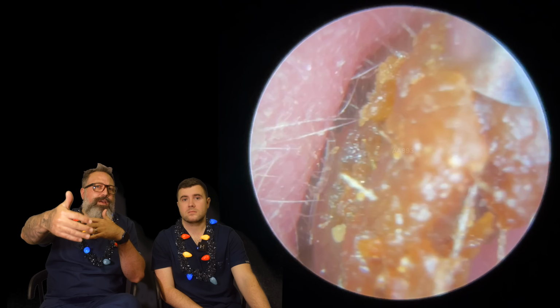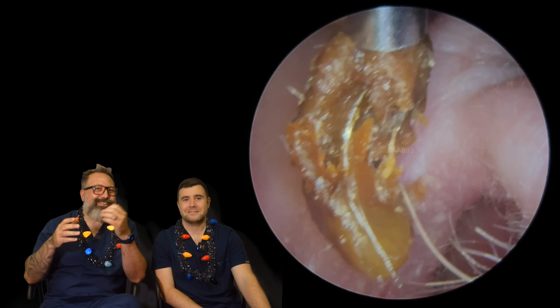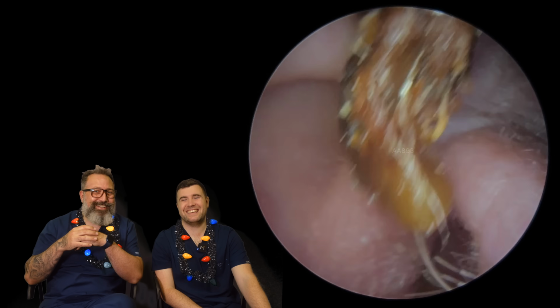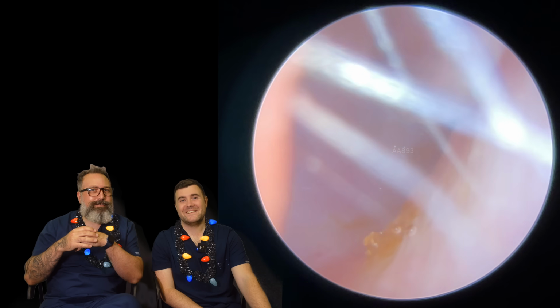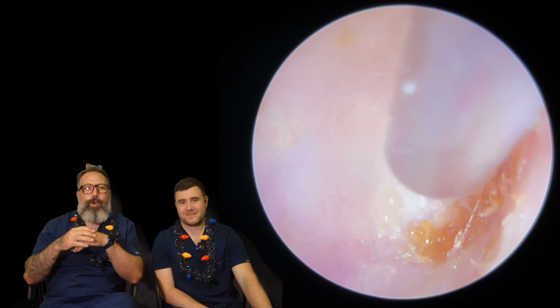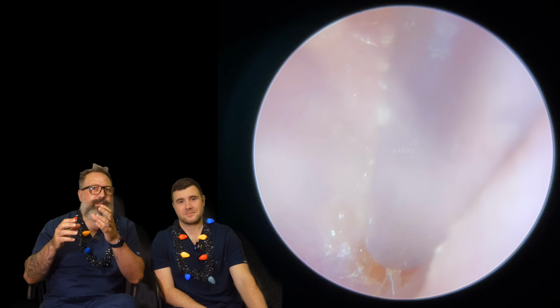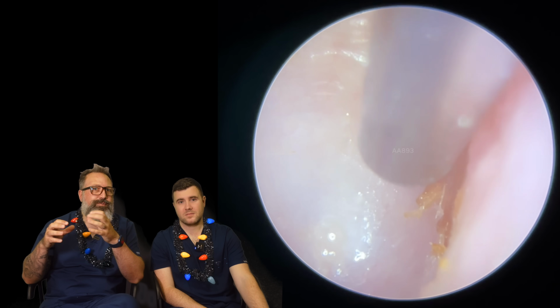So you've got your eardrum, but this is about halfway down the ear canal in most cases, and it's a very, very thick layer. I bet it's not false fundus. I bet this is the wrong patient. But hang on, let me not say anything else, just in case it's the eardrum. No, it is the false fundus. There you go. So you get this really thick layer that has its own blood supply, so you can't suck this out. This would have to be surgically removed.